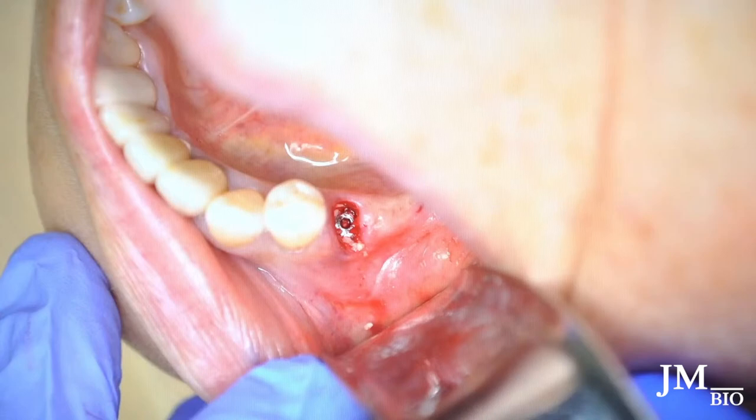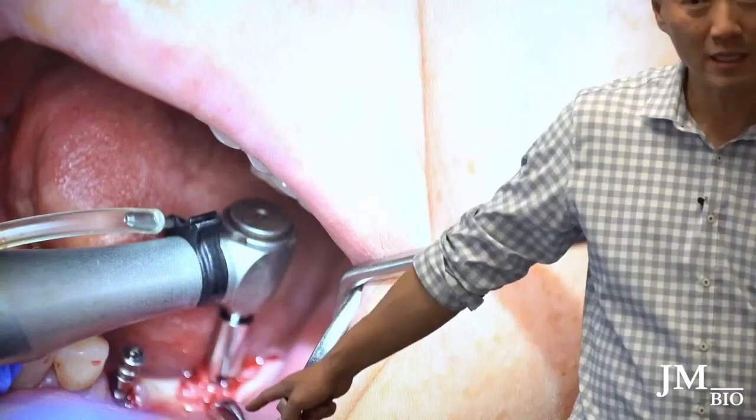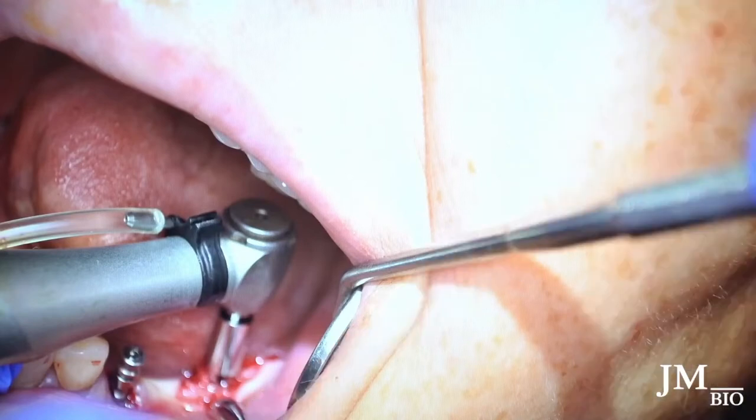I like to place the anterior implant first because I can use it as a guide for the distal implant. I placed an impression coping on the anterior implant to use as an angulation reference when creating the osteotomy for the distal implant — buccal-lingual or whatever direction I need to go.